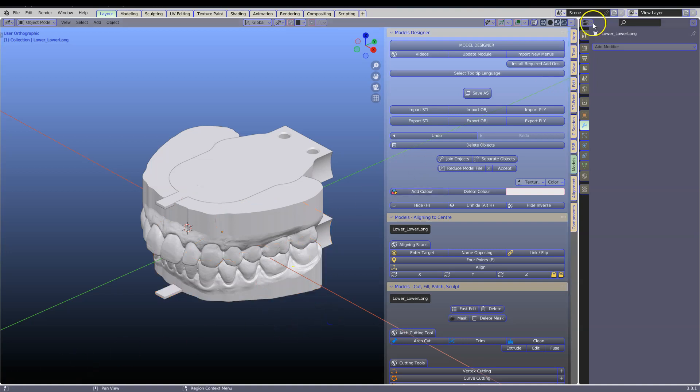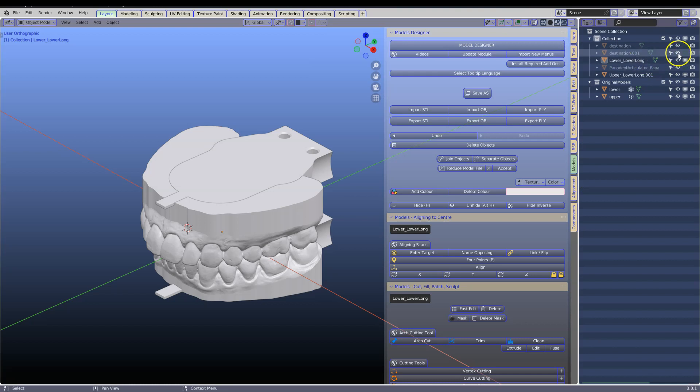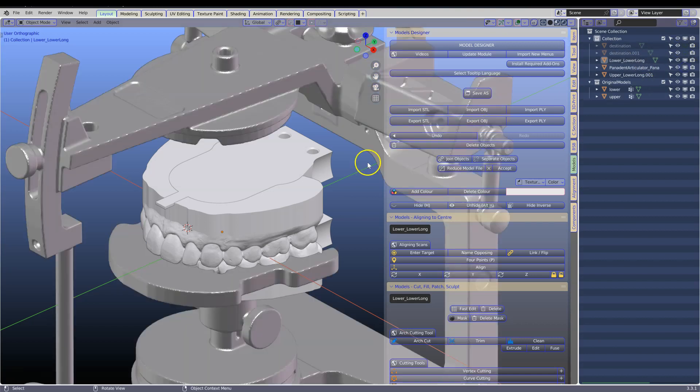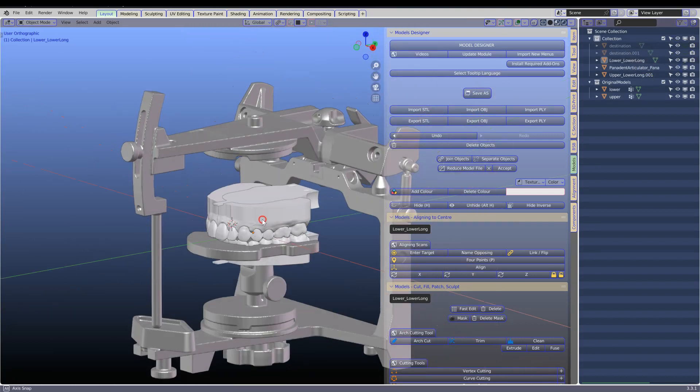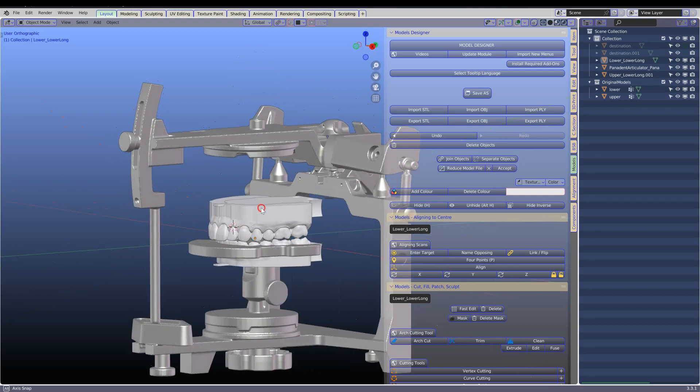To re-examine, we're going to bring in the articulator, and this is what it then looks like.